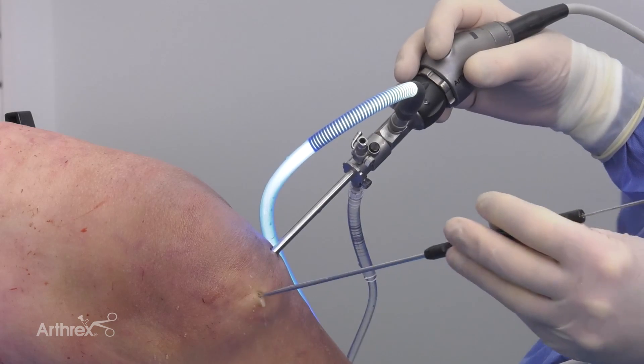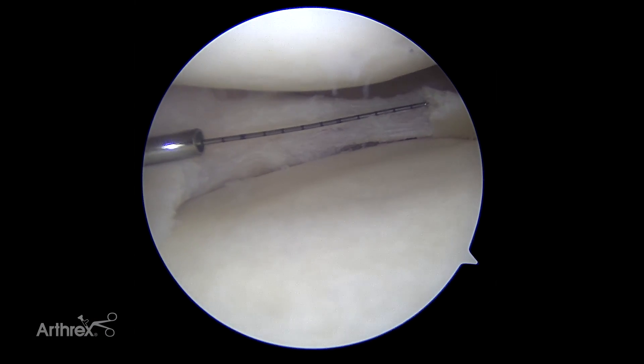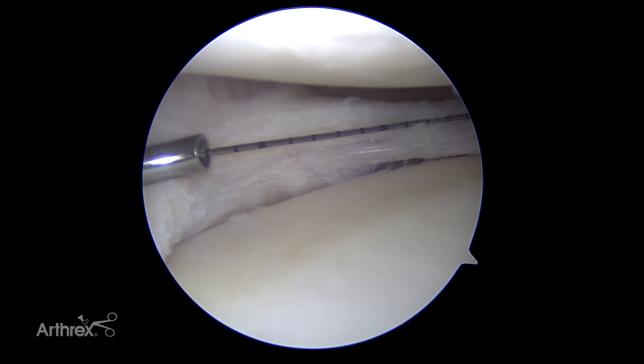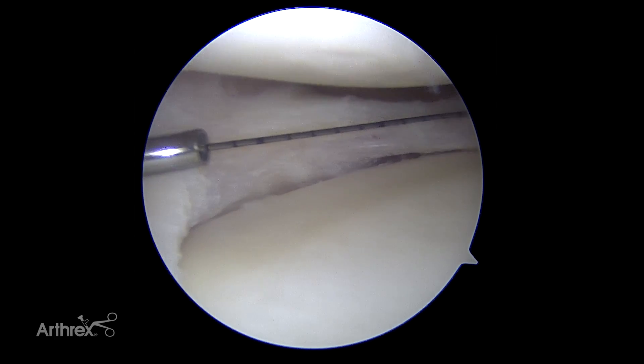Now we've got to measure our defect. These are two-millimeter marks — 10 is the bold mark. It looks like 22 to 24 millimeters in terms of our anterior-posterior dimension.